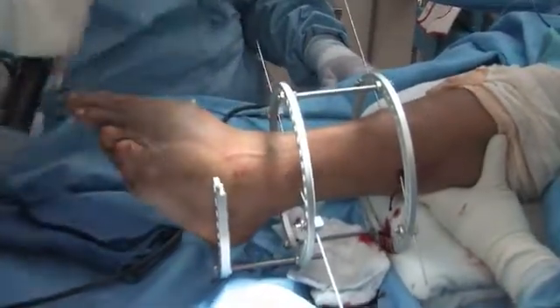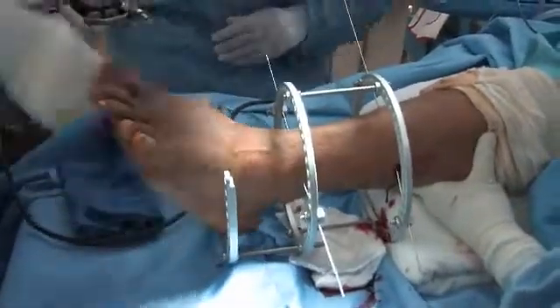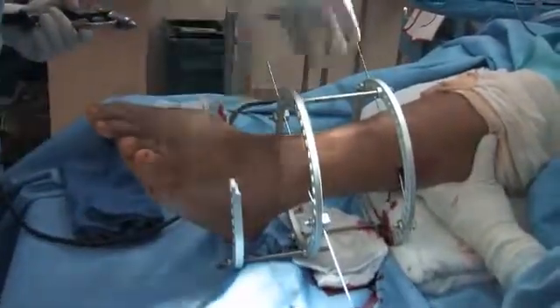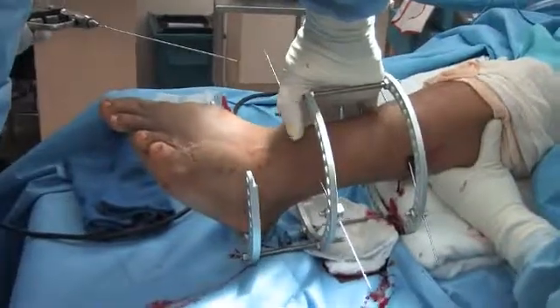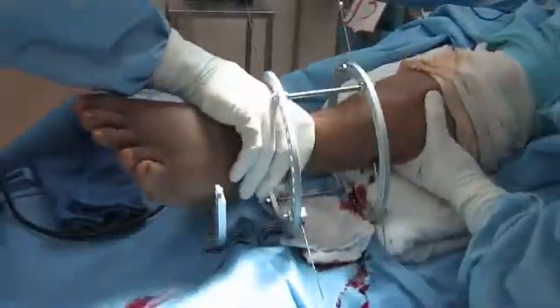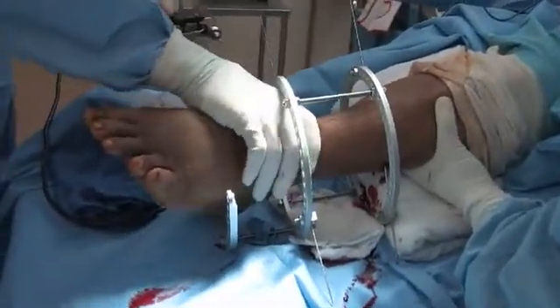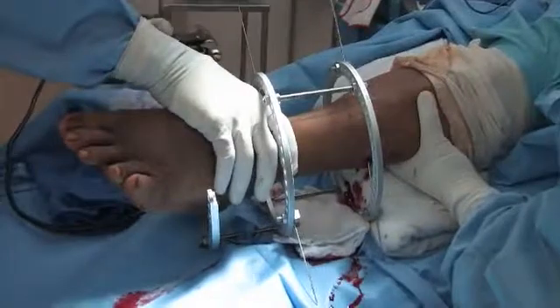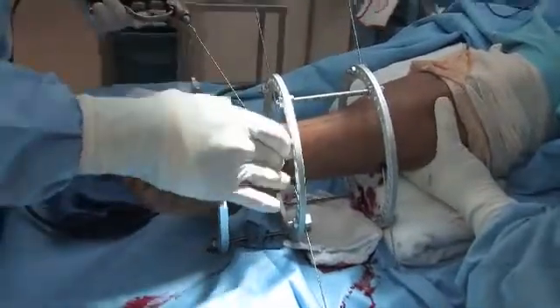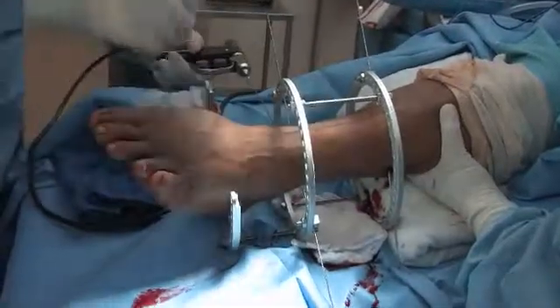So now we'll apply a wire from medial to lateral. You want to be cautious here. Some of the landmarks I use, let's go ahead and externally rotate this, is the posterior surface of the tibia. We don't want to get behind there. And then we're going to come out anterior to the fibula. So this is my axis here of where this wire will go.